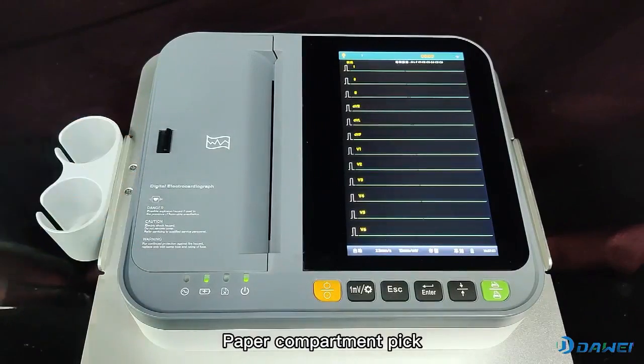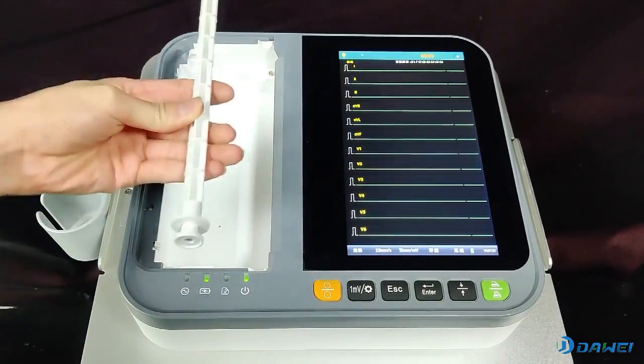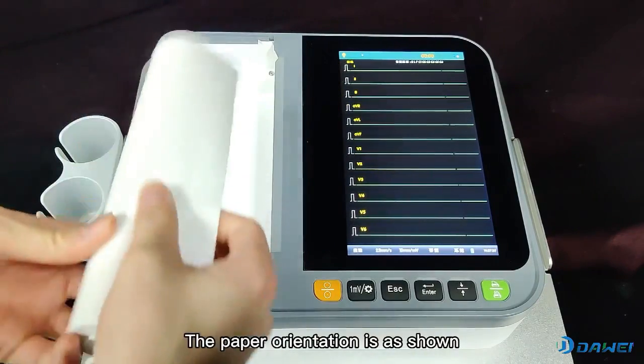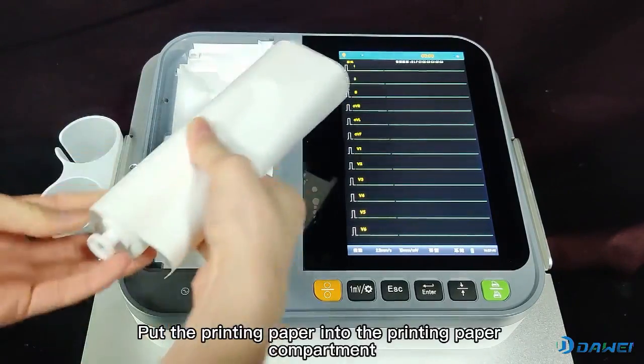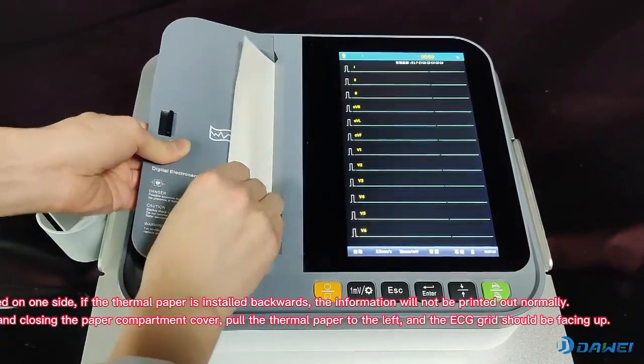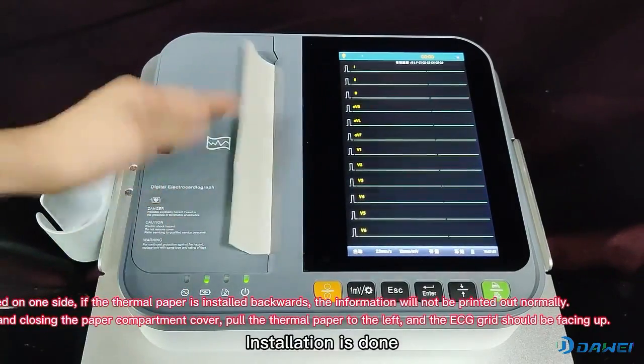Open the paper compartment by pressing and holding, then swiping to the left. Take out the printer paper. Thread the printing paper into the printing paper shaft and take out the paper reel. The paper orientation is as shown. Put the printing paper into the printing paper compartment and close it. Pay attention to the flush direction. Installation is done.